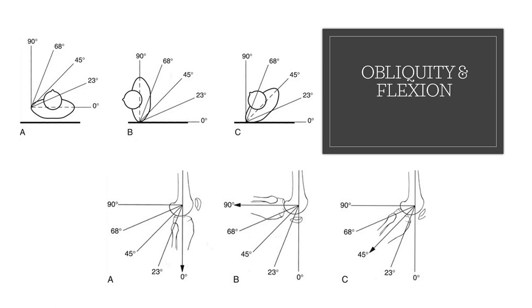Don't assume a sponge will set the correct angle. Depending on how far under the patient the sponge is placed, it could be more or less.